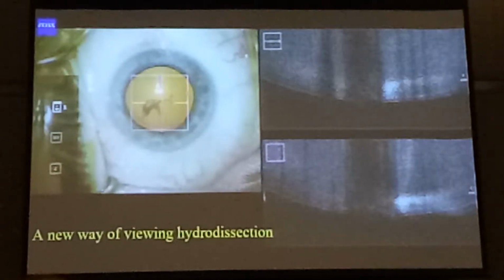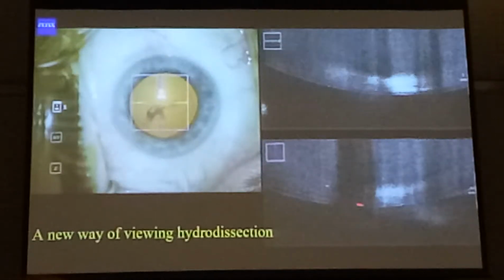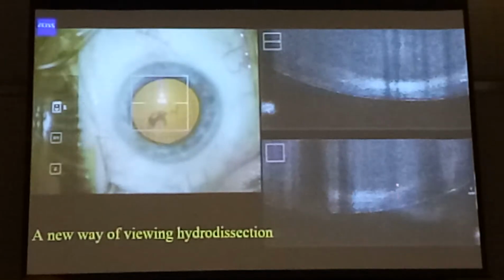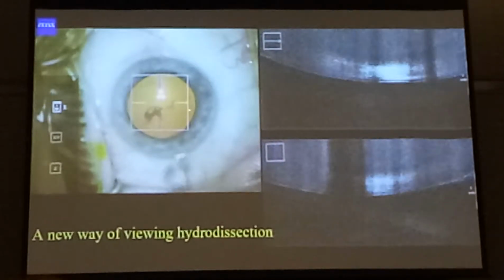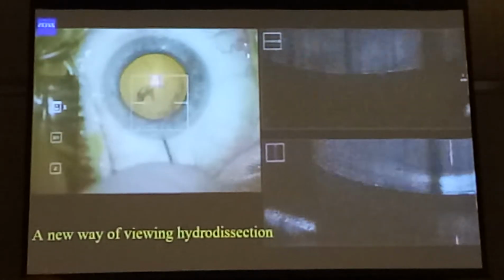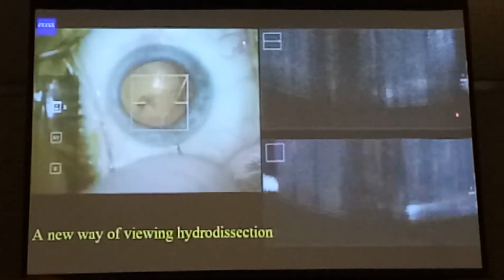Now we're going deep. I'm now showing the posterior lens capsule. Here you can see even before hydrodissection, there's a little grey area where the cortex is sitting, the nucleus is there, there's the epinucleus there. Now here's my cannula going in. I'm going to hydrodissect from the right, so you want to watch on the right to see whether you can see fluid coming in. So I'm there now, and I start hydrodissecting, and what do you see?